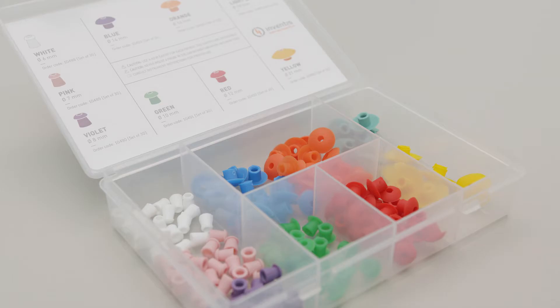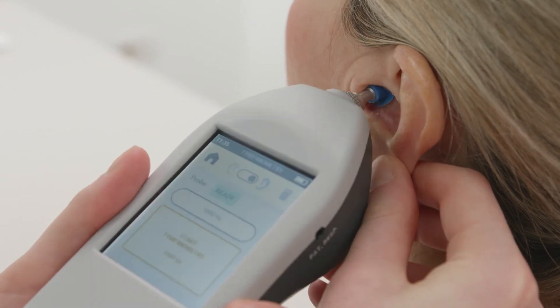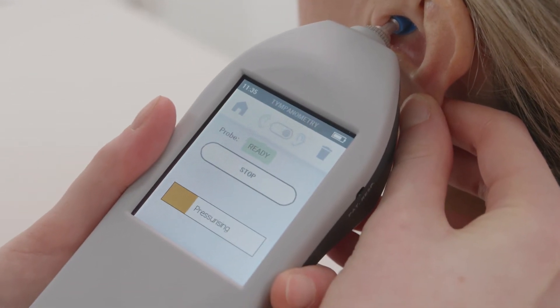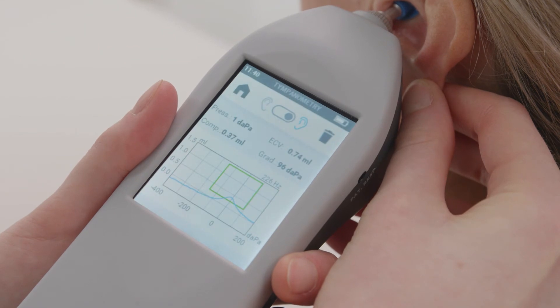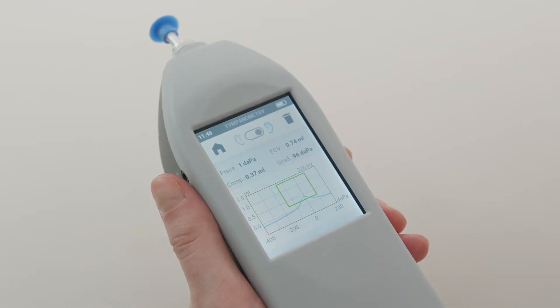Once you are ready, select the ear tip that best suits the patient and introduce the probe into the patient's ear canal. The exam starts automatically once tympani detects a cavity. A bar will show the progress of the test. The results of the examination will show you the tympanogram, the pressure value at the tympanogram's peak, the ear canal volume, the compliance and the gradient.